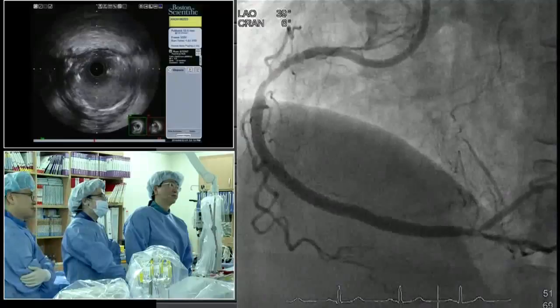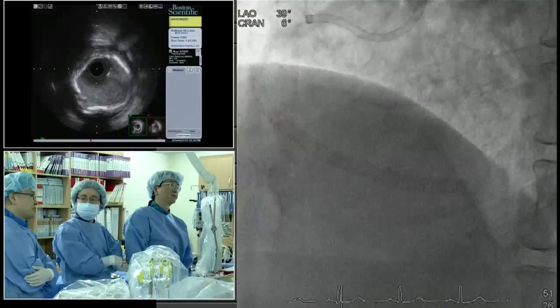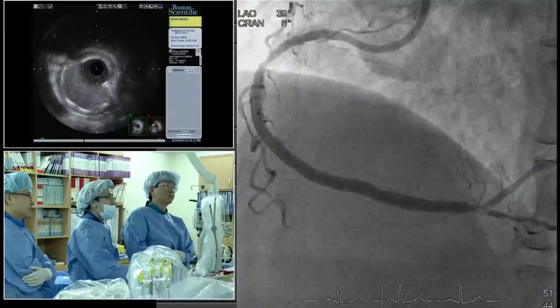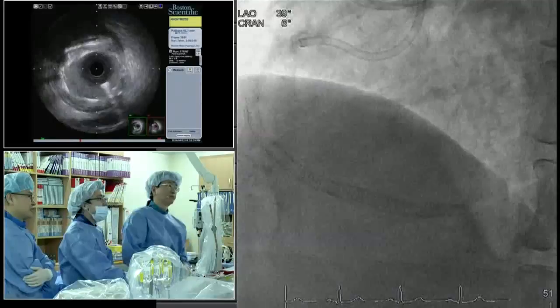How about the distal dilatation with a drug eluting balloon? Maybe that's another option. I think that's a good point. I'd probably use kissing balloons to open it and then put a drug eluting stent into what I think is the continuation of the right and not stent the PDA. That's probably what I would do.